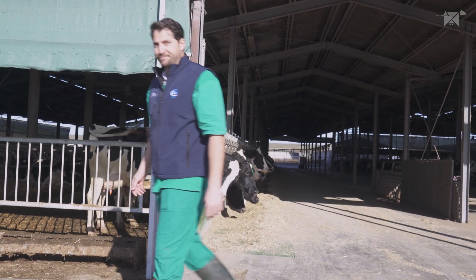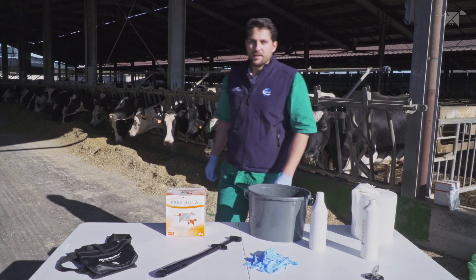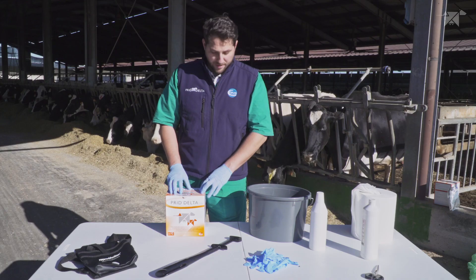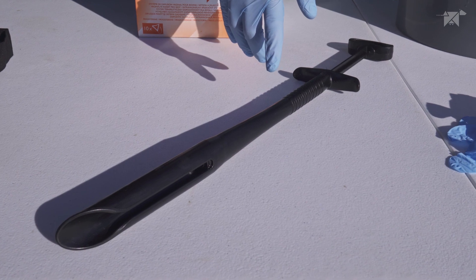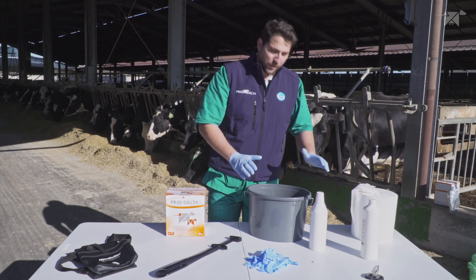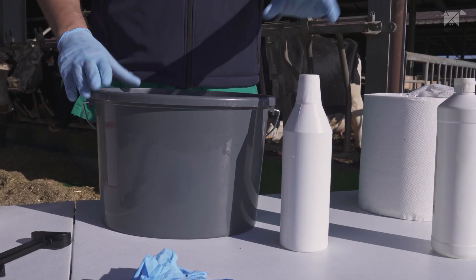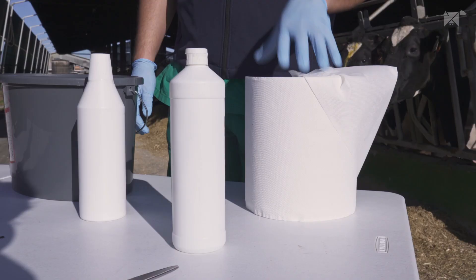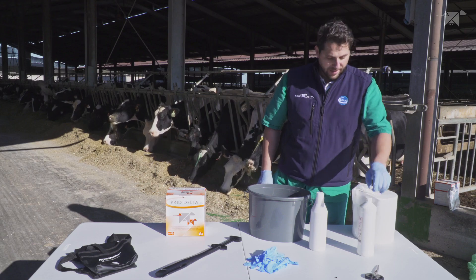Now let's look at what we're going to need. To apply Predelta we will need the Predelta device, Predelta applicator, disposable gloves, a bucket of clean water, a suitable disinfectant, paper towel, obstetrical lubricant, and a pair of scissors.